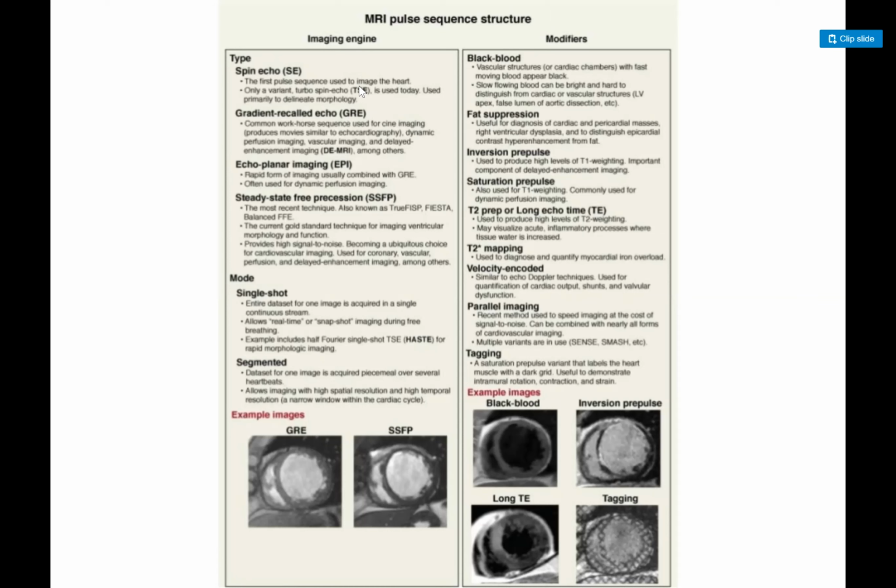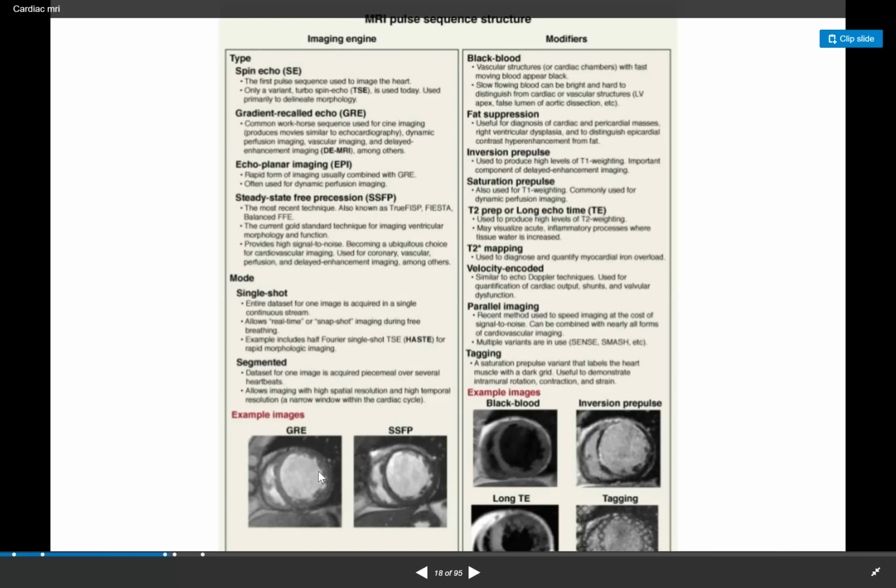Then the other name you will hear is called steady state free precession. Precession is the name of the spinning, and this has different names in different vendors. Again, some companies call it TrueFisp, some call it Fiesta. We have Fiesta available in our scanner, balanced FFE, and this is mainly used for function, cines. The cine imaging that we see, as you can see down there, are example images.